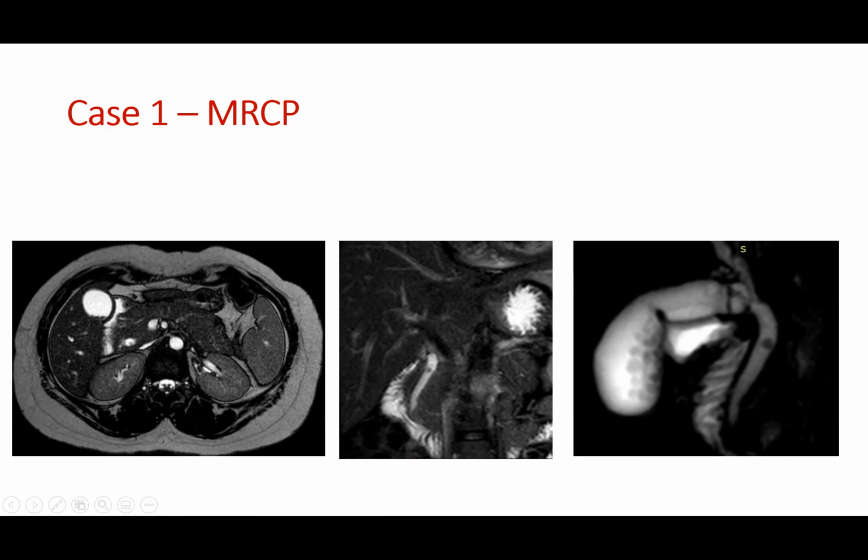They want to know whether the position is important in the assessment of the gallbladder, the positioning of the patient. In ultrasound? In ultrasound, probably, yes. No. They have mentioned what it is.